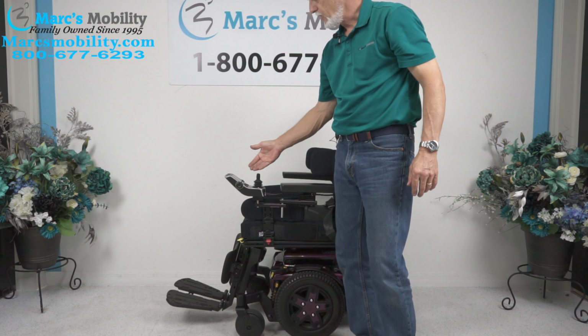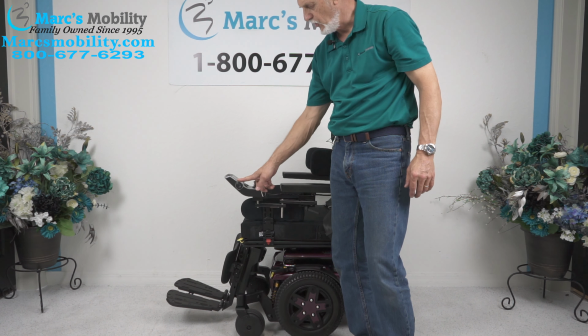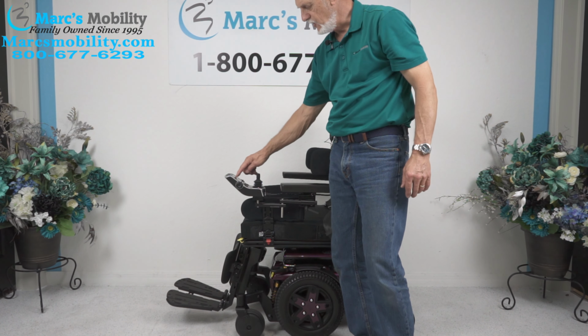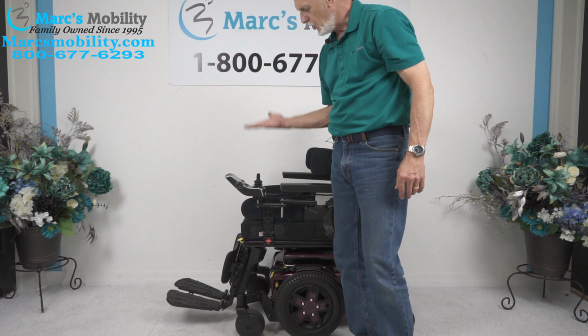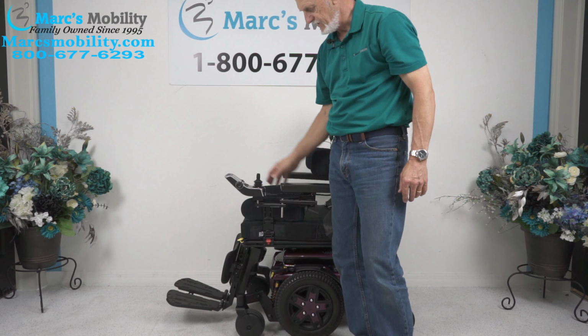So all the functions on this chair have to be worked through the joystick. You would use your button on the left, push it forward until you see a picture of your seat on here. Whatever's yellow on your seat is what the function is going to be. So I want the seat lift to go up. I just want the bottom cushion to be yellow. So I'm going to go just to the bottom cushion, which it is now.